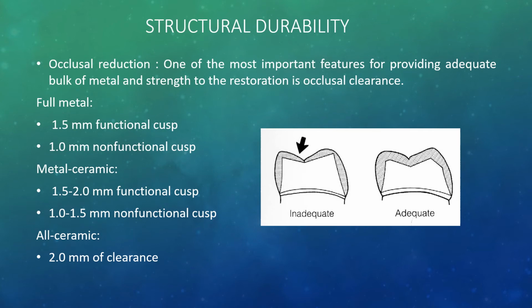if you have a great idea about the different kinds of tooth preparation burrs that you have, each burr has a different diameter. So if you are choosy, and if you're cautious enough to choose which kind of burrs you are going to use, then definitely you will have an idea what the thickness is. So when you are trying to purchase any kind of tooth preparation burrs, you need to see the manual and evaluate which burr is what thickness. So that is how you know the diameter or the width of each burr.